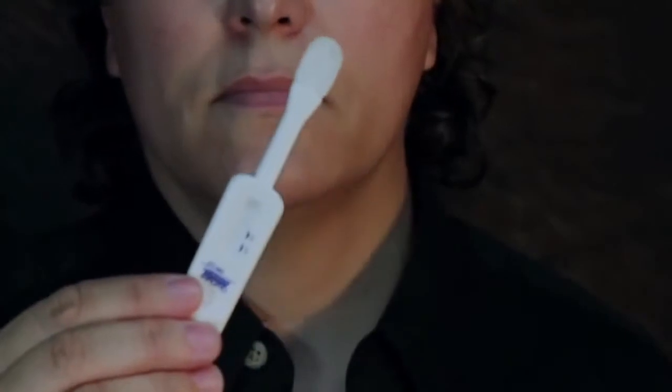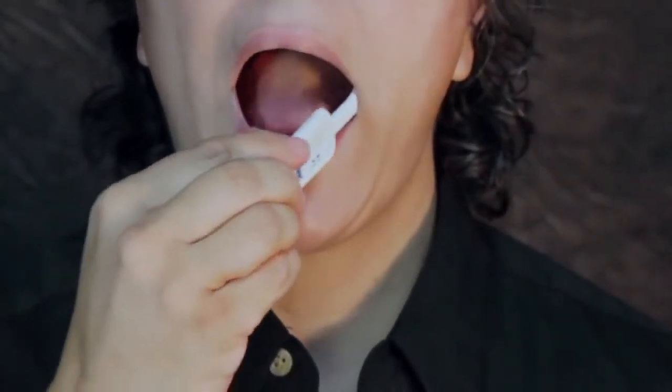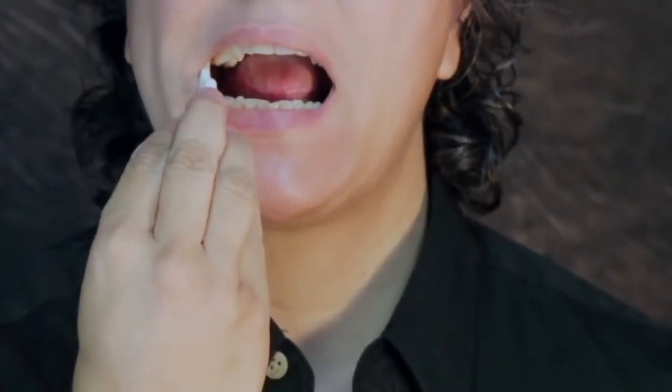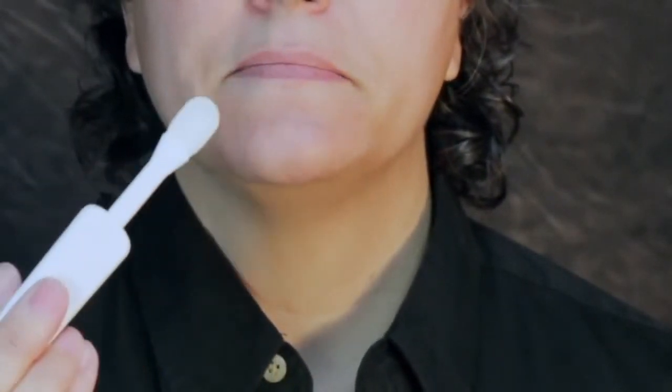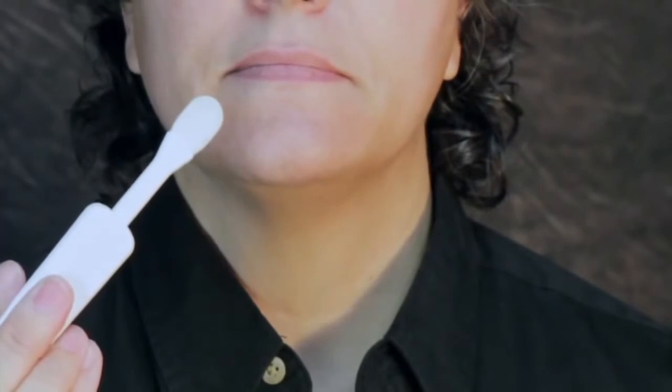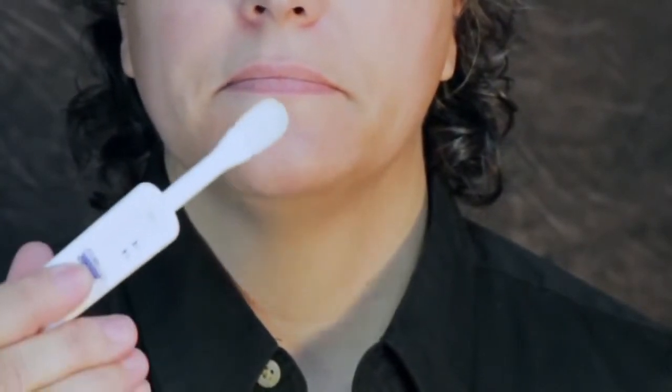Direct the person to place the flat pad above the teeth against the outer gum and gently swab completely around the outer gums, both upper and lower, one at a time using the flat pad. Do not allow the person to swab the roof of the mouth, the inside of the cheek, or the tongue. Both sides of the flat pad may be used during this procedure.